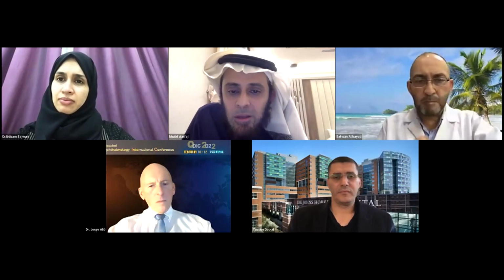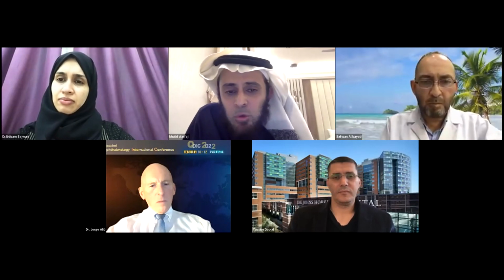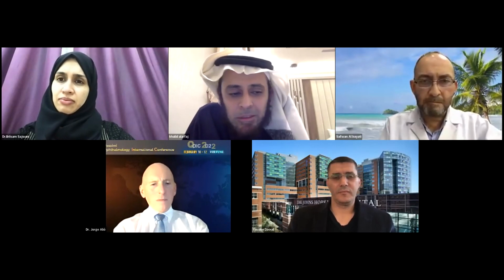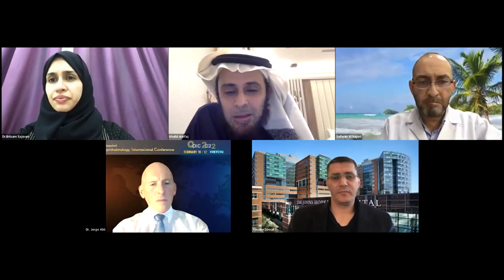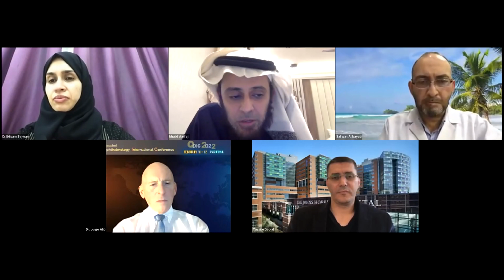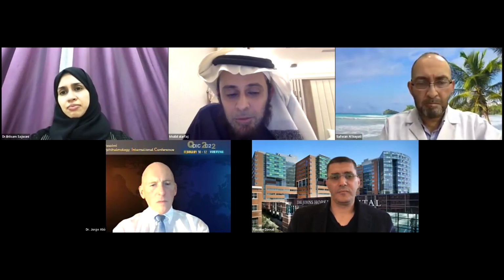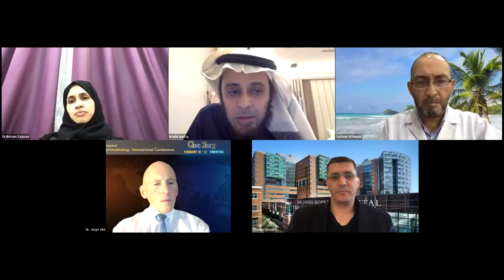But we target, as you know, 0.2 or even emmetropia. For emmetropia or -0.2, I think the EDOF will not do well at near vision. They might give very good intermediate vision, and they are very forgiving. They have very minimal photic phenomena, and it might replace the monofocal lenses market if the price goes down. This is what I see in the future.